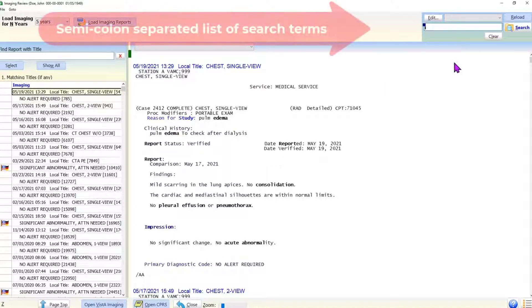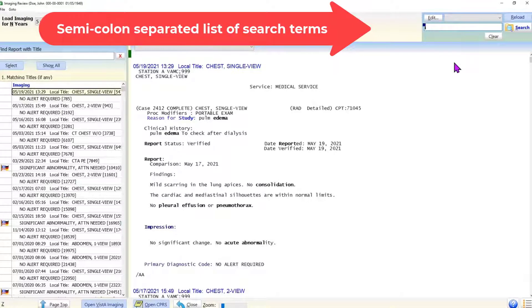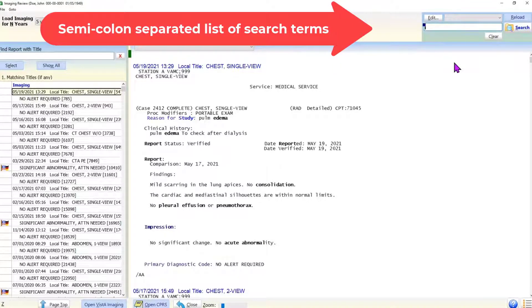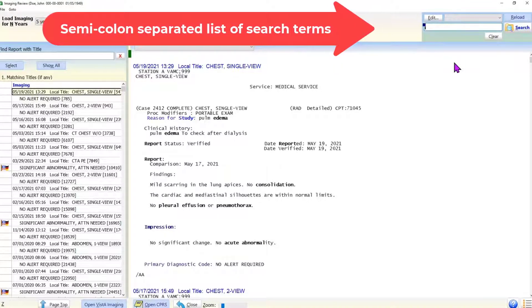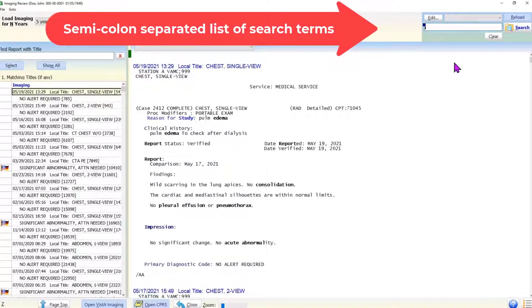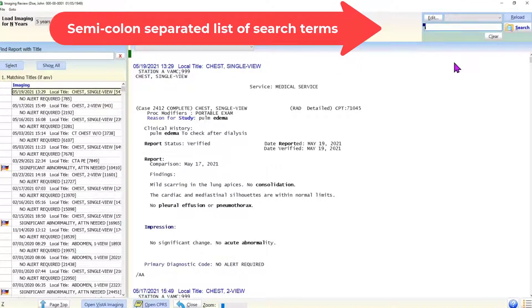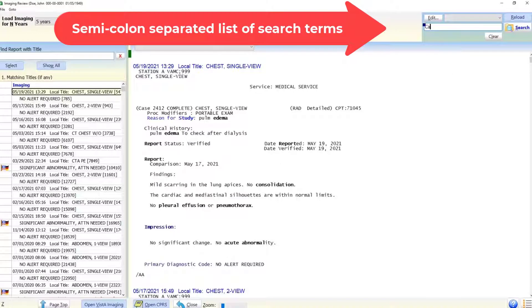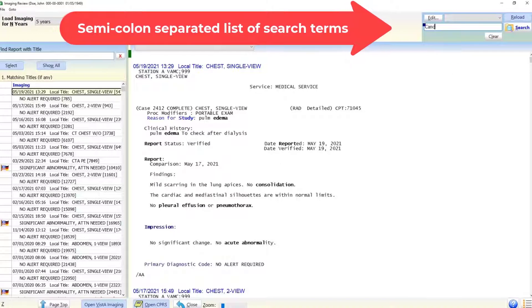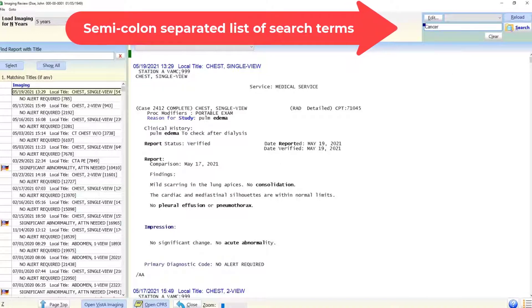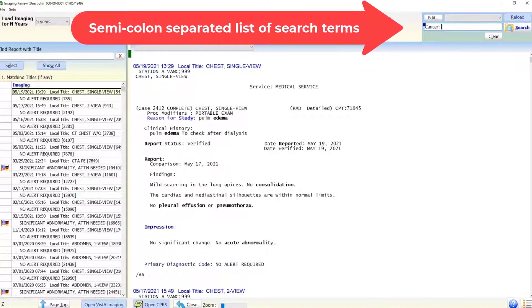For example, using the user interface on the top panel, we can simultaneously search all the loaded imaging reports for the keywords like cancer, malignancy, tumor, and nodule.